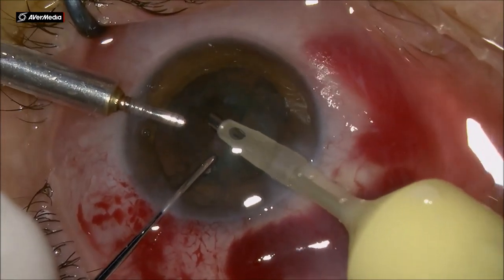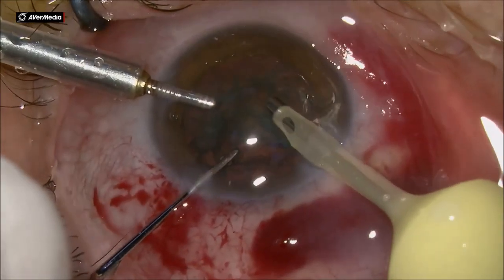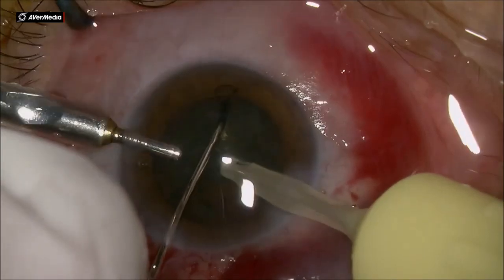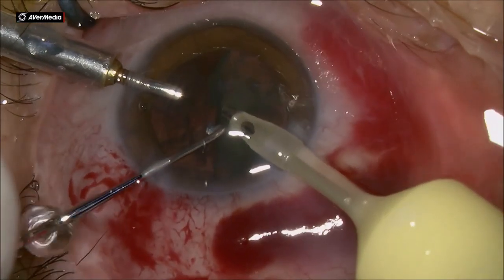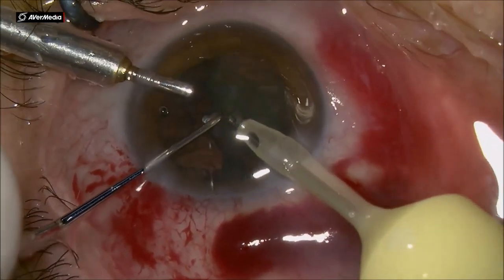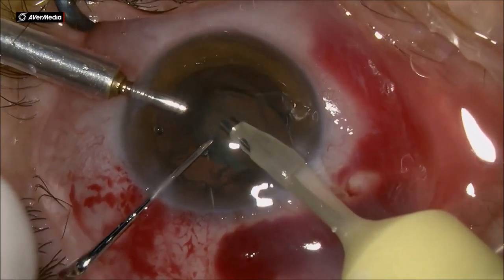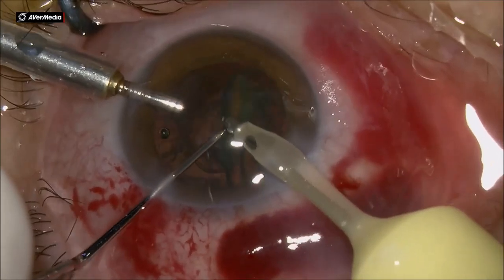And half of the nucleus is out, rotating the nucleus inside the bag, and then do a horizontal chop on this half of the nucleus, using the phaco needle just mechanically to hold the piece in place, and then it's very easy to aspirate using the chopper to feed the quarter into the phaco tip, and the last quadrant is removed out of the eye.